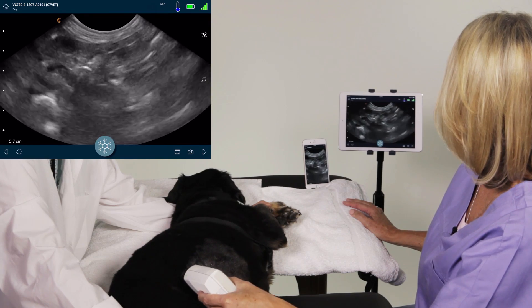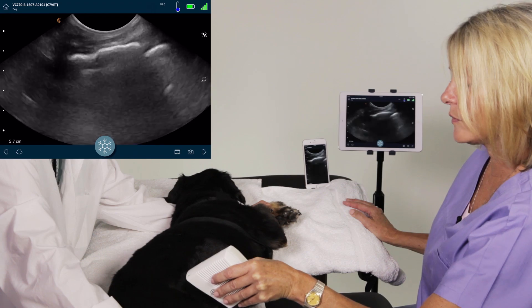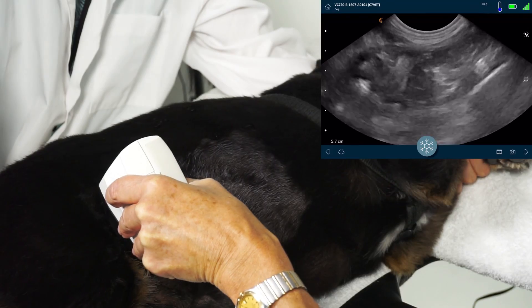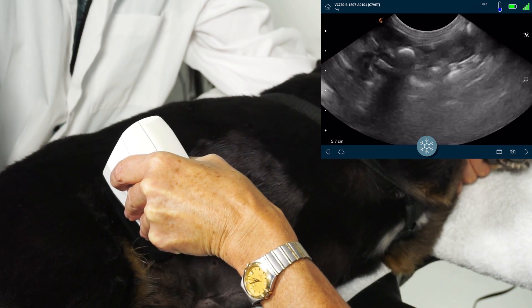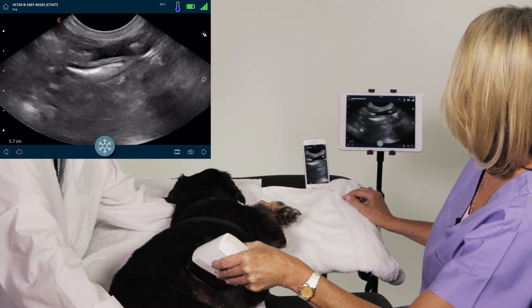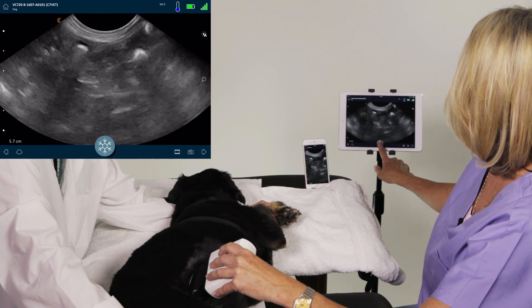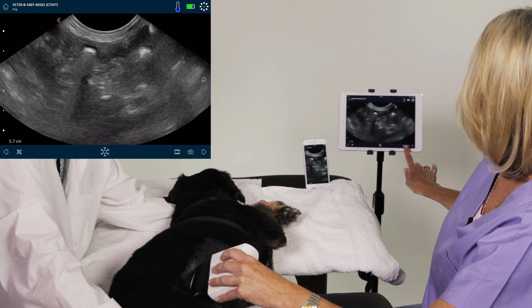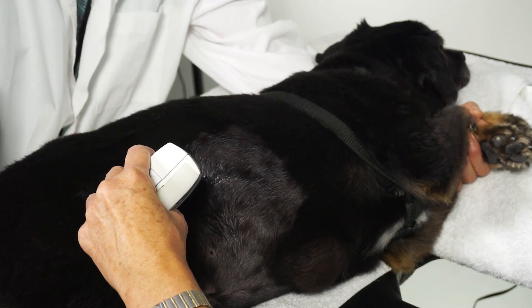And then we come back, and I can also slide — directly moving the whole transducer — which will help me see the bowel right here. It goes out of view, we come back, like so. Taking an image is very easy as well. We just ask the system to freeze, and here, with a little camera, we take our picture. We can unfreeze.